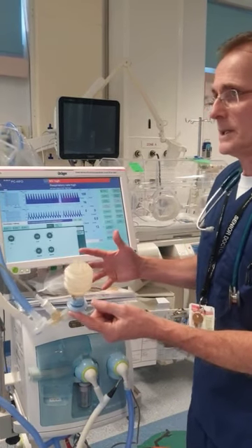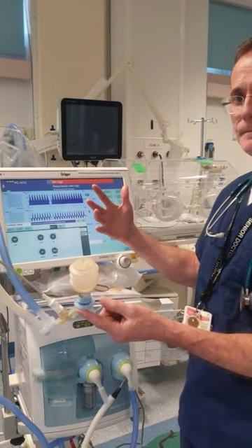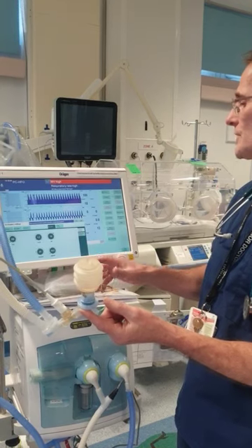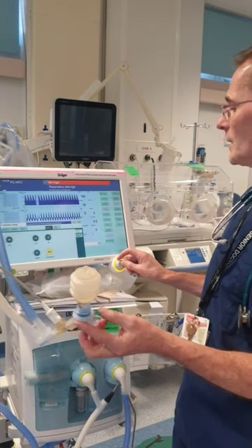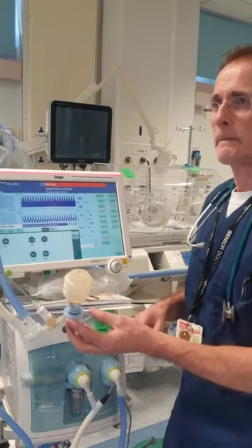So let's say I've gone up to 18 centimeters of mean distending pressure, still no rise in saturation of the baby, but everything else is fine. So it's tolerated the move, but he or she hasn't got better yet. 5 minutes have passed. I will increase the mean airway pressure again to 20.